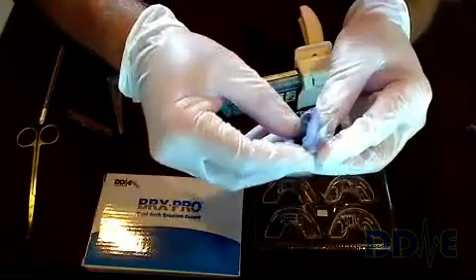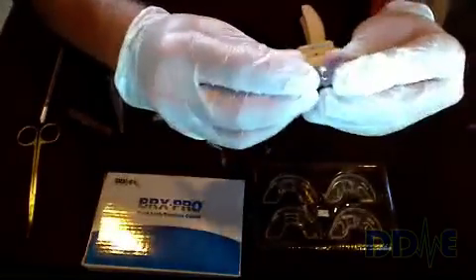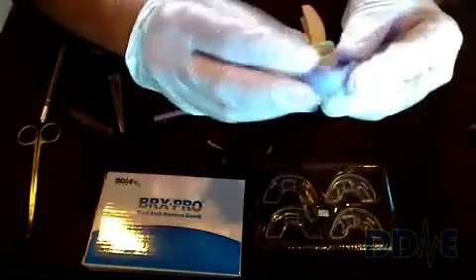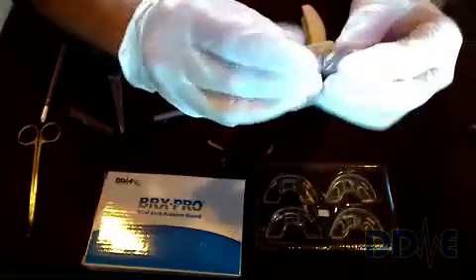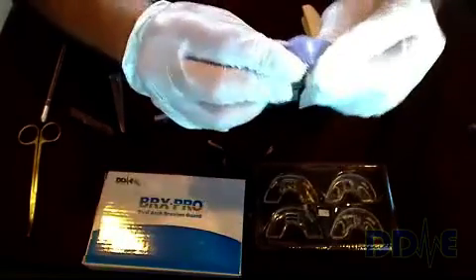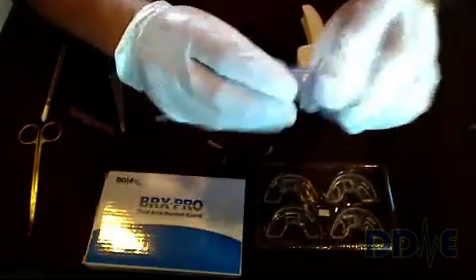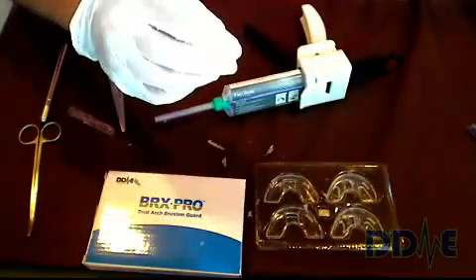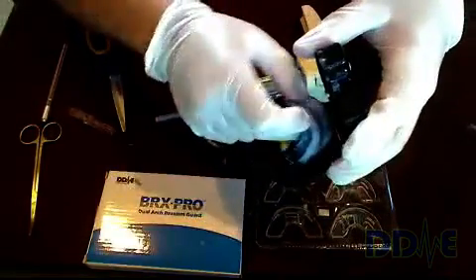Now do the same exact steps with the upper insert — roll in the front edge first, line it up, and snap it in. You actually feel it snap in. So we have our upper and our lower trays, and what we end up with is a finished appliance.